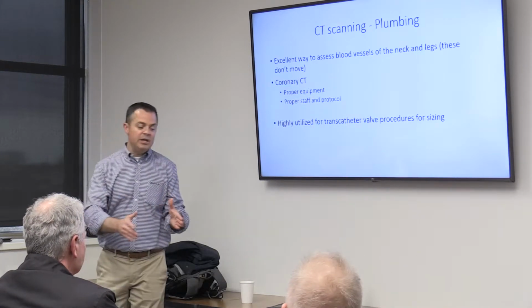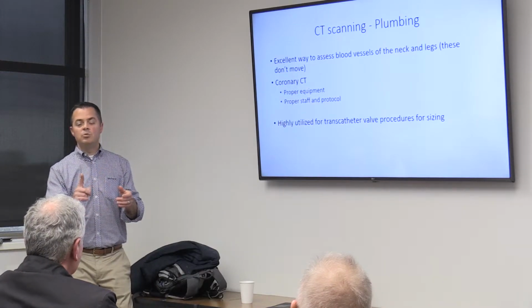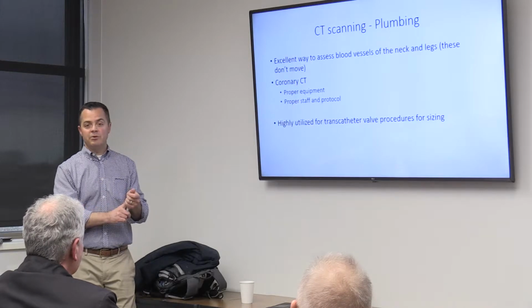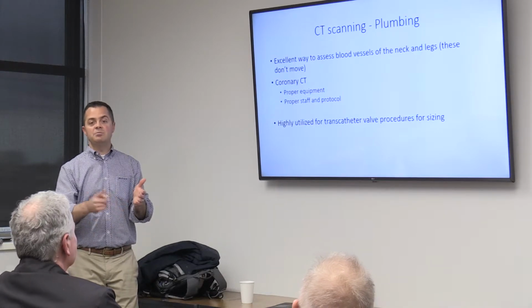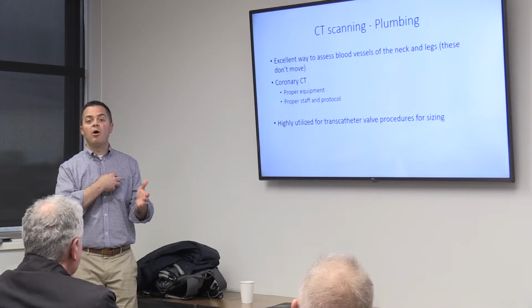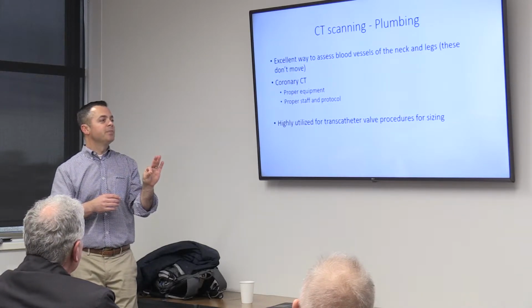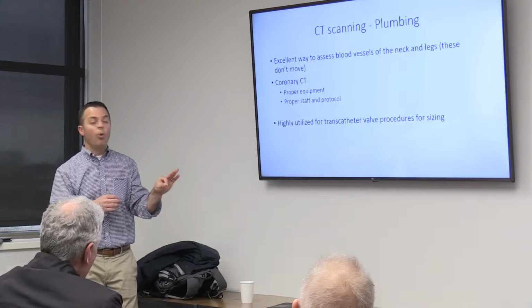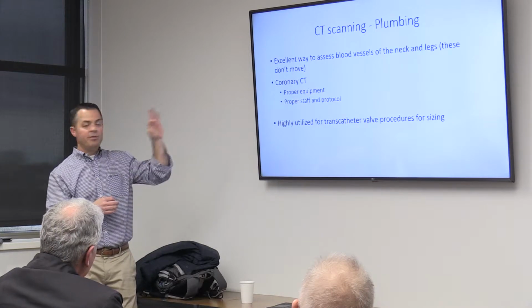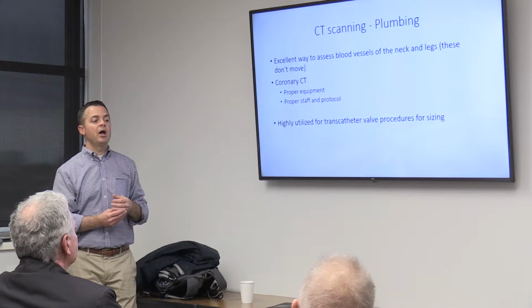But this can be a very good test to look for blockages. I put catheters in people for a living, and some of these scans can show detail that even impresses me. Catheters work so well because I can park them right in your artery, take pictures and acquire really good images. That's the gold standard for blockage disease. But this is getting there. It's getting there. And we've had several patients come through here now.